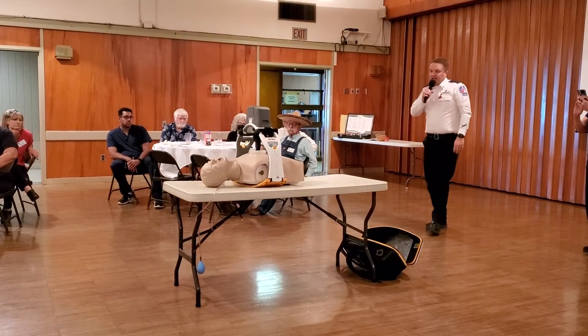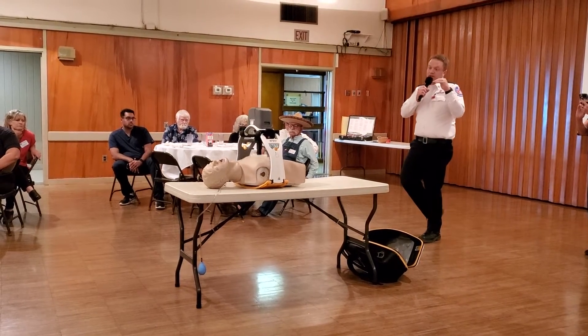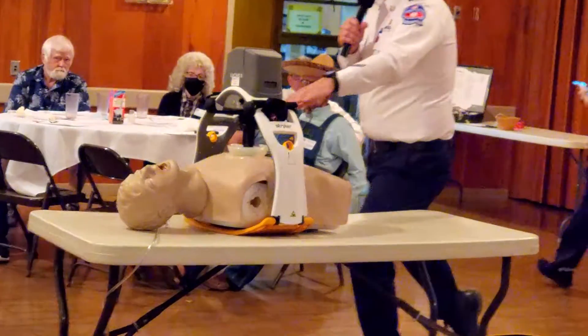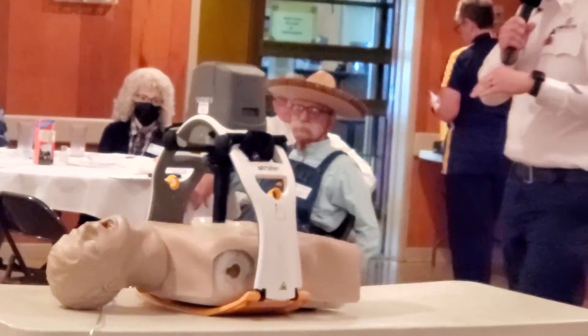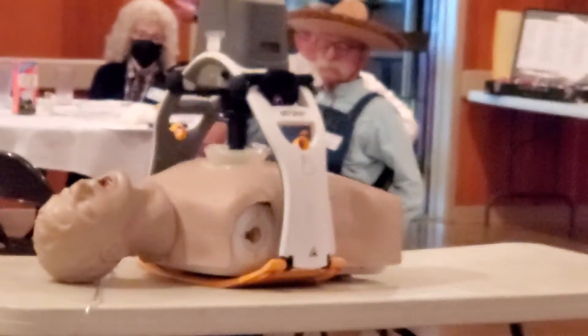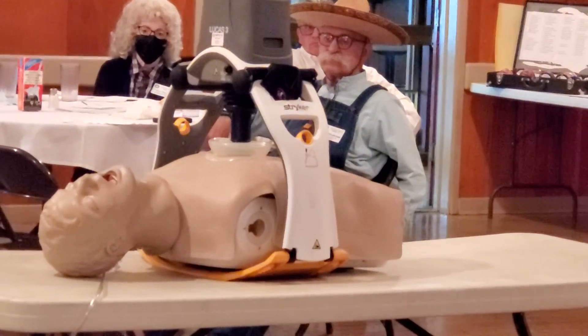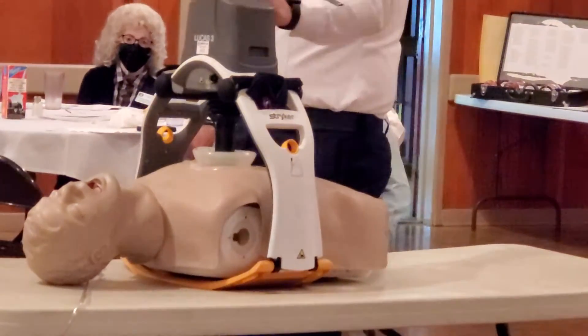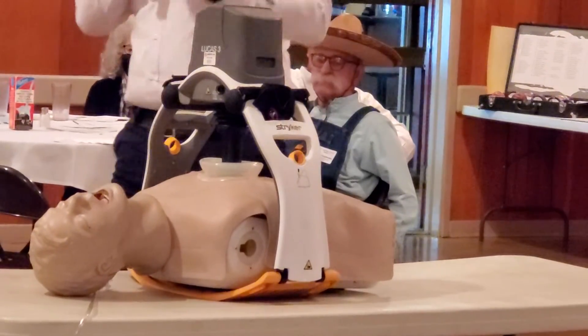The machine is designed to go down two inches and stop — that is the most effective compression depth. Basically, wherever I tell it to start, it's going to go down two inches. That portal allows it to pause for rest and breaths and then start again.